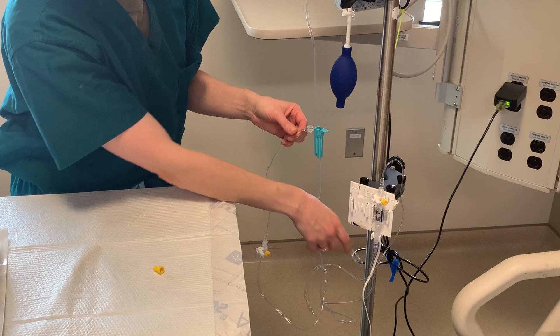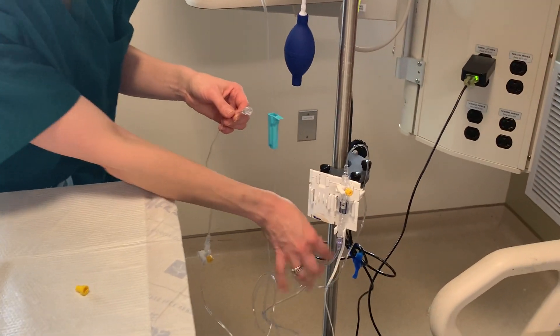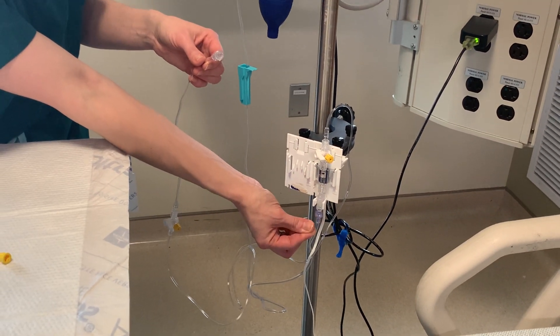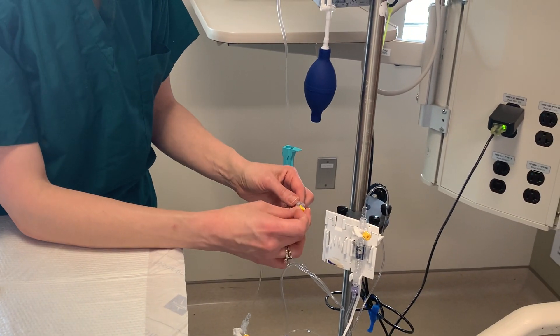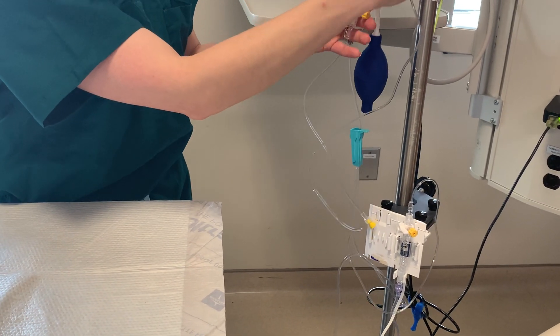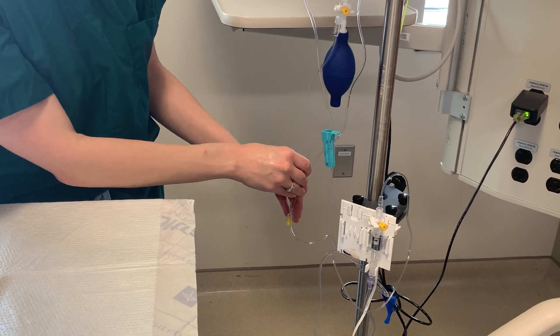Some facilities have transducer tubing with a pigtail instead of pinching prongs, so instead you will just pull the pigtail out and that will prime the fluid through. Once that's done, put the sterile cap back on the end and you can hang it up on your IV pole until the physician is ready to attach it to the patient when they are done inserting the line.